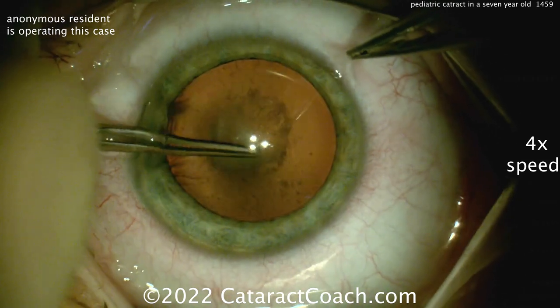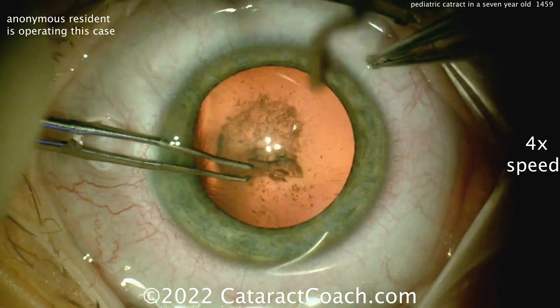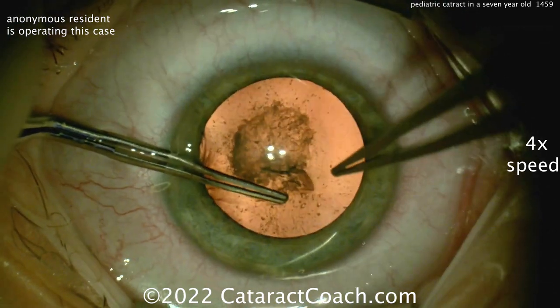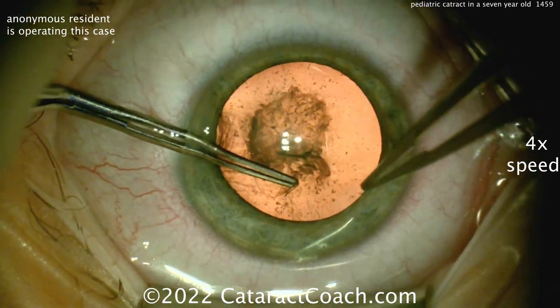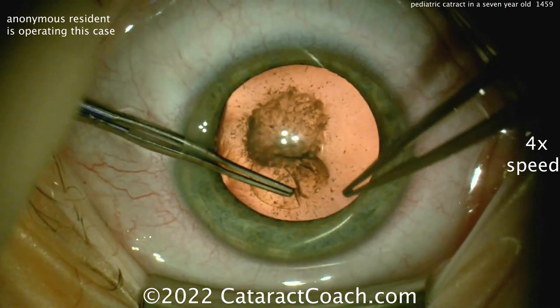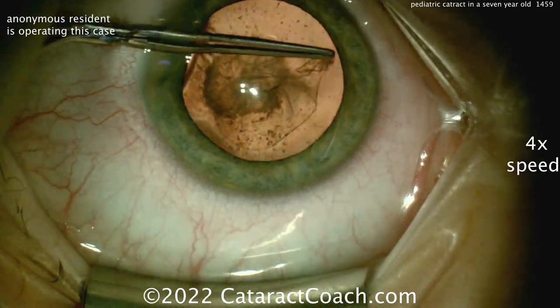A totally avascular incision is going to be a little slower to heal and maybe not as strong. Here you're using the forceps to create the rhexis. The rhexis in a 7-year-old is going to be more challenging — this capsule is going to be very elastic. A trick you can do is stain the capsule with trypan blue dye, which makes the capsule a little less elastic. So even though you have a good red reflex, the blue dye is not so much for your view but rather to make the rhexis a little easier to perform.